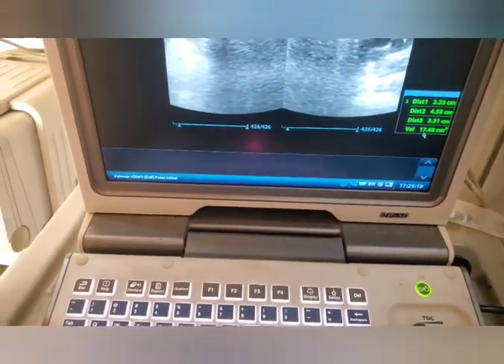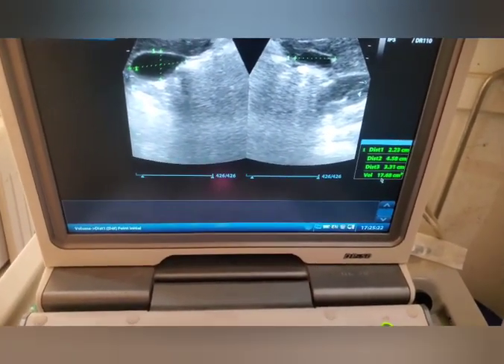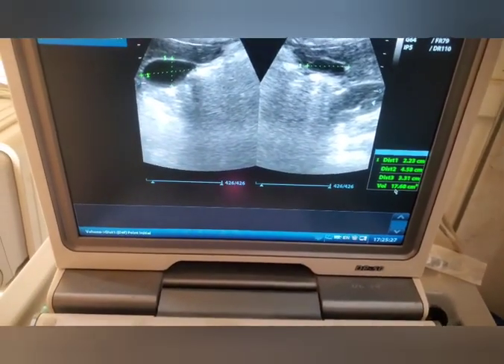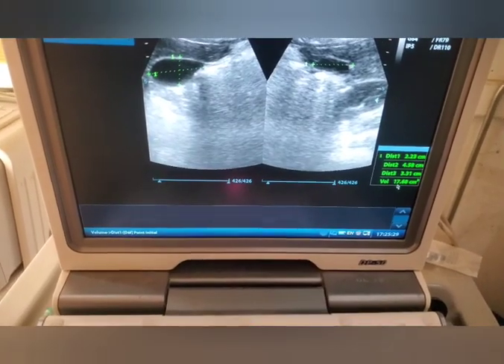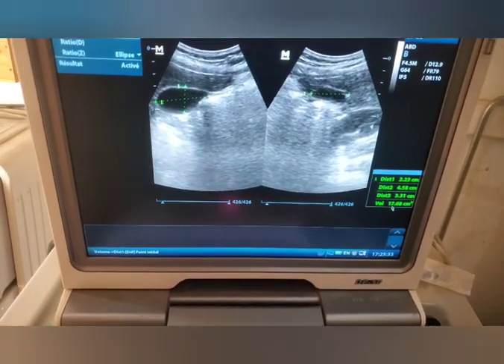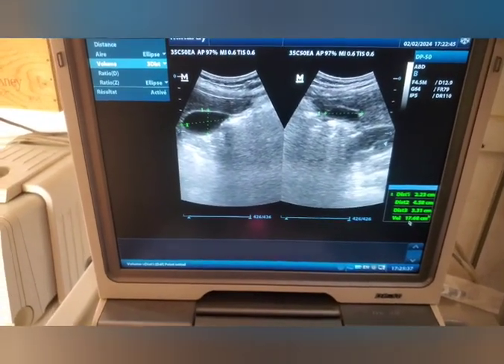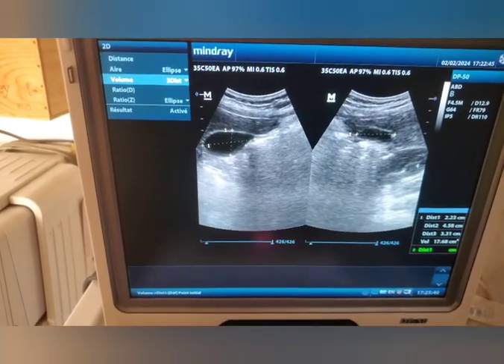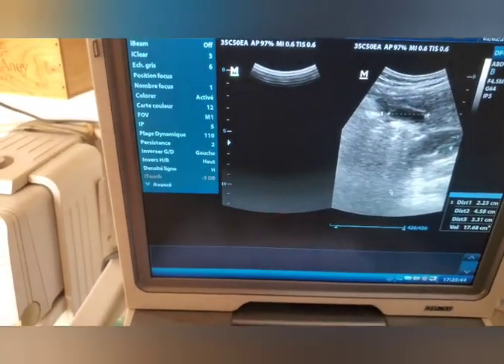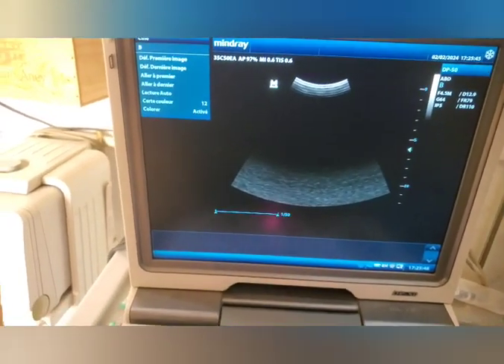And now in this case, the volume is big as such because I have not eaten. Generally, when you eat, you want to see the gallbladder contract. You can ask somebody to eat, particularly egg or a fatty food. Is it clear? You're going to see how the gallbladder constricts, and it can help you to know the diagnosis of an acute cholecystitis, because when the gallbladder constricts, the patient may have pain. Is it clear? So those are the different things that you have to note here. So let's unfreeze and then go back to the B mode. So that's that. Is it clear?